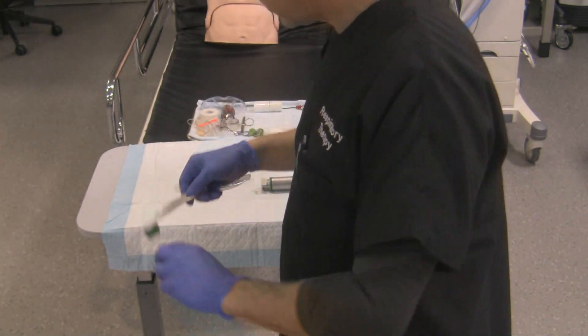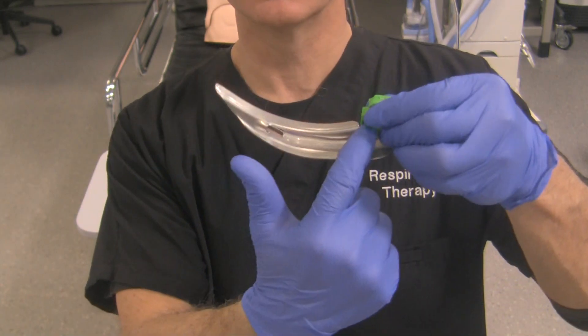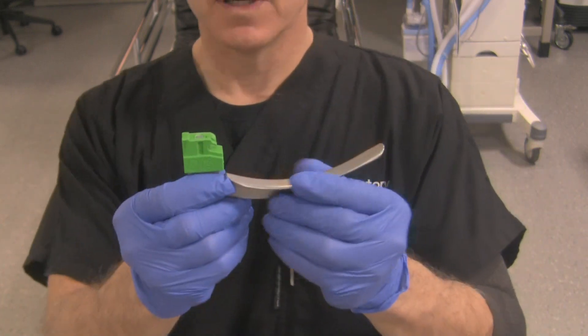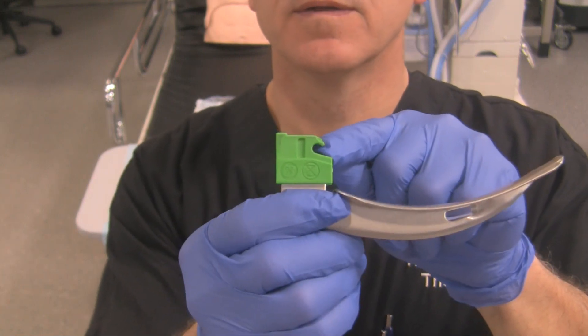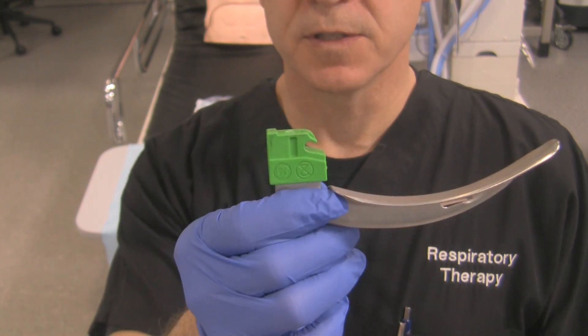If we look at the blade, there is no light bulb anywhere in here. There's simply a fiber optic conducting system right over here that takes the light from the handle and shines it out at the end of the blade. The other thing about this blade — if you take a look, you can see there's a little slot right over here. That bar on the handle slides into that slot, locking the two together to ensure it functions properly.